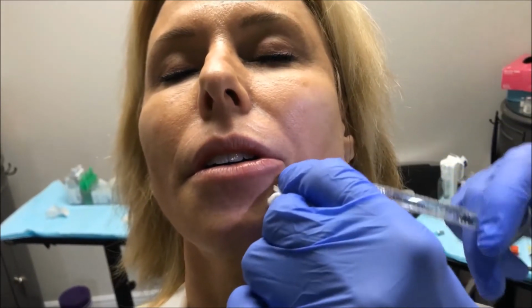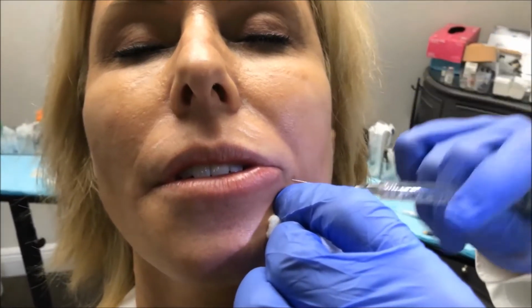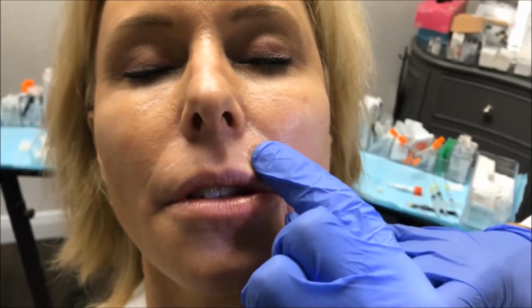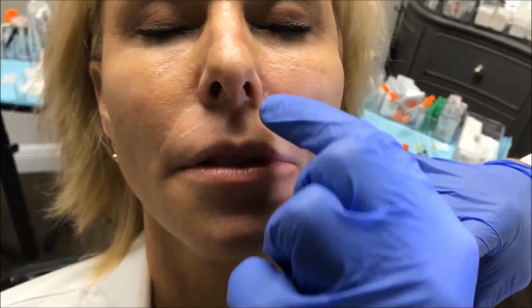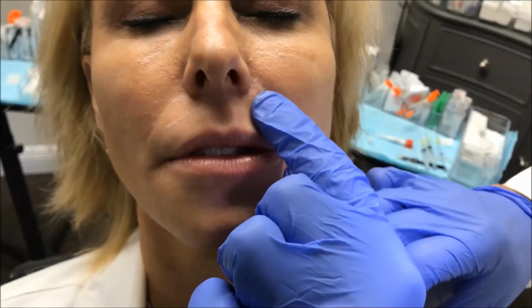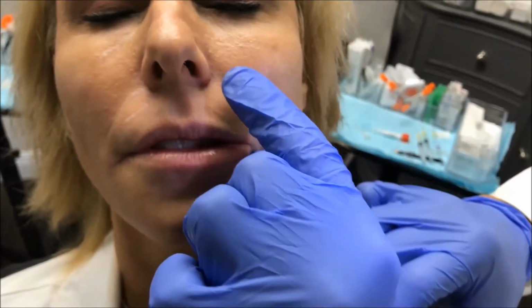Good. Doing okay? Yes. Now we're going to go to the cutaneous upper lip, because before when Amy was talking, we noticed there was a little bit of a ledge here. So I'm putting just tiny bits of filler here to smooth in the upper lip. Good.